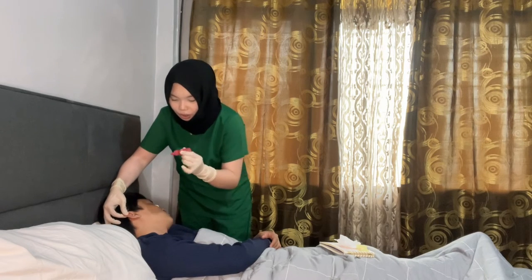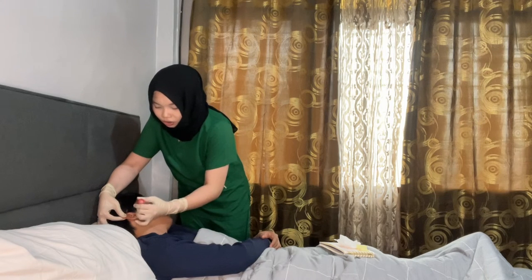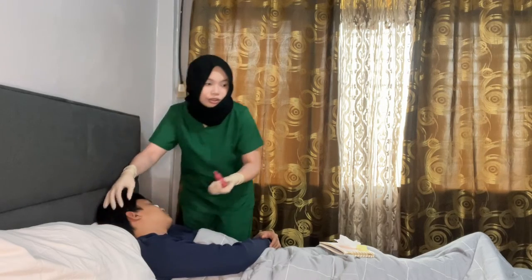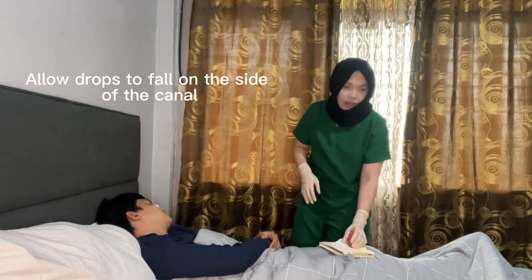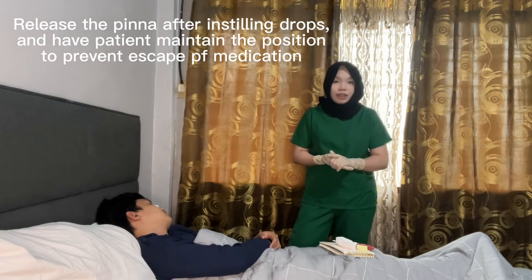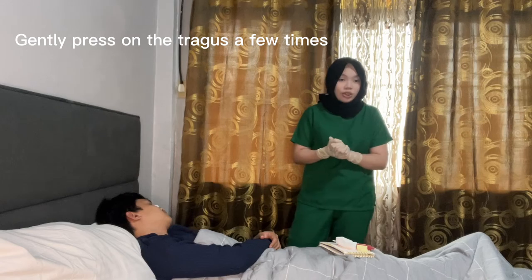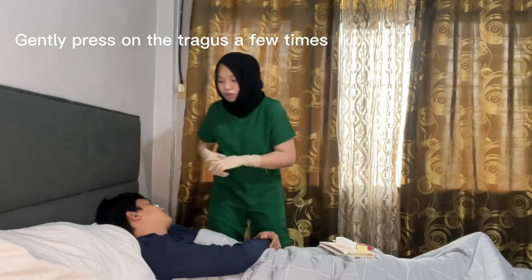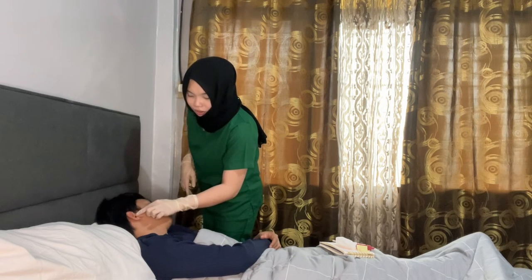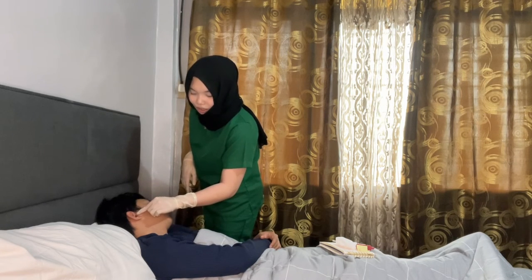Drop the solution into the ear. Do not touch the auditory canal. Allow the drops to fall into the side of the canal, then release the pinna after instilling the drops. After that, gently press the tragus of the ear to help push the medication into the ear canal. Press the tragus gently a few times.